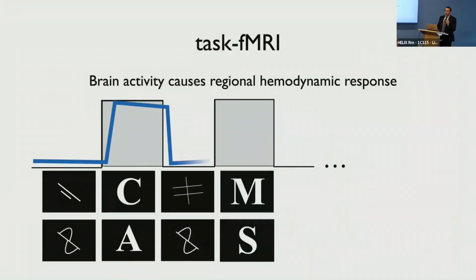Essentially, you try to figure out where in the brain the MRI signal goes up, then down, then up, then down during the examination. Any part of the brain where the signal went up when language was happening and down when it was not should, theoretically, be related to language.